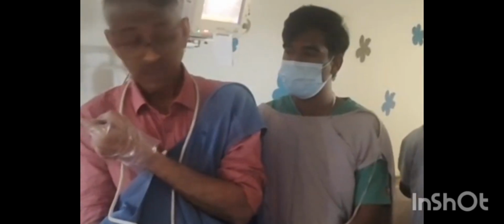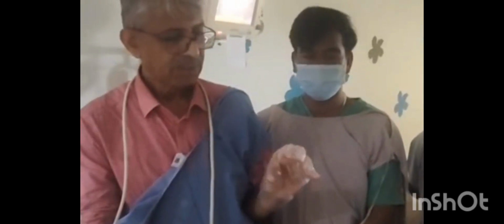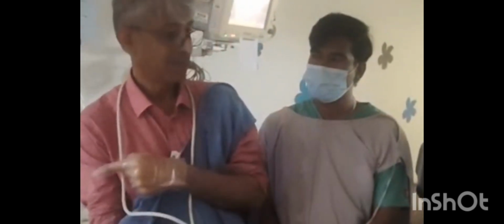Even in the context of a high heart rate, that means the heart rate is 131, 132, the speed of the heart rate usually will not make the coronary artery so prominent. Usually in older children, they reduce the heart rate to get good views of the coronaries. But here, despite a higher heart rate, the coronaries are well appreciated.